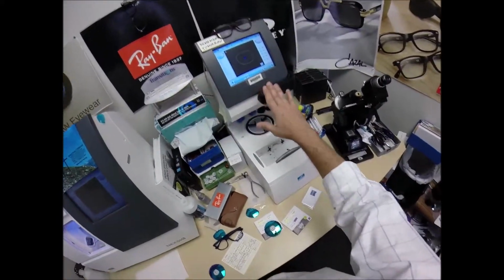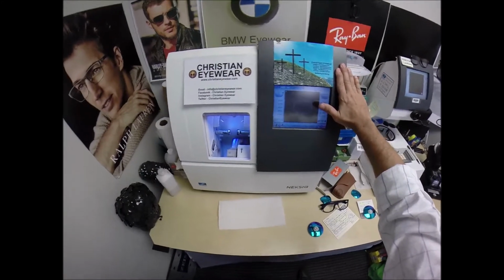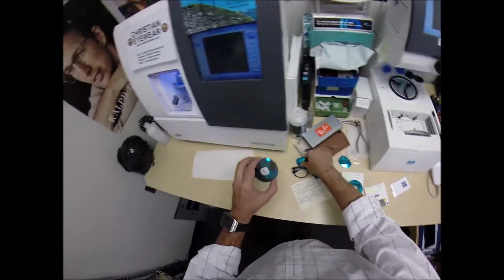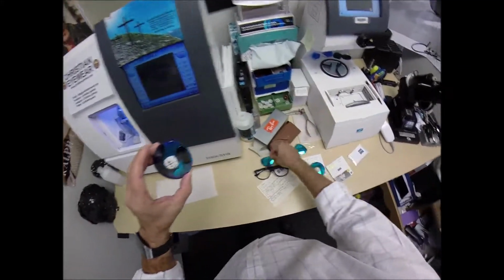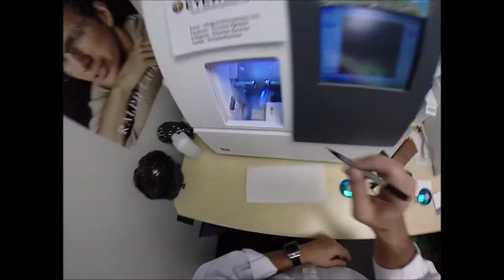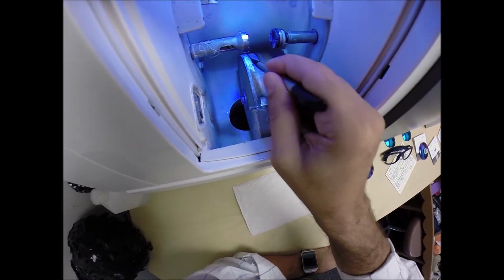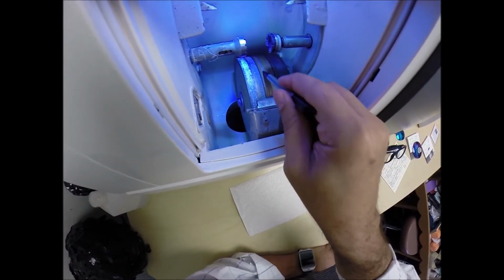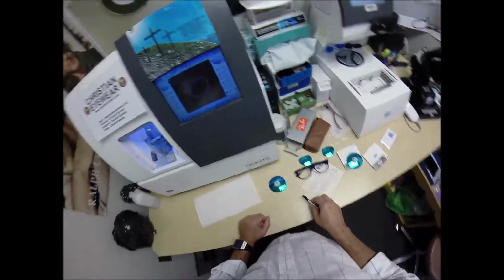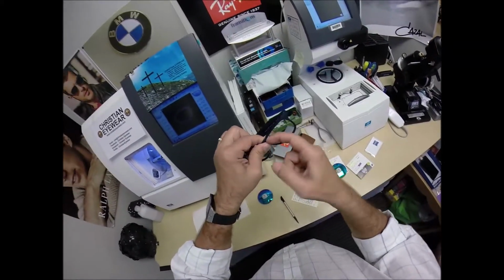So this is the blocker, this is the tracer, this is what's known as the edger. It's going to edge your lenses down from this size to this size. Actually, let's grab the right lens. And it's going to do that on this cutting wheel. It's going to be a diamond crusted wheel that's going to grind away your lens material until it's the final size. This wheel in the center is going to put the V-shaped bevel onto the lens so it stays inside the bevel of the frame.